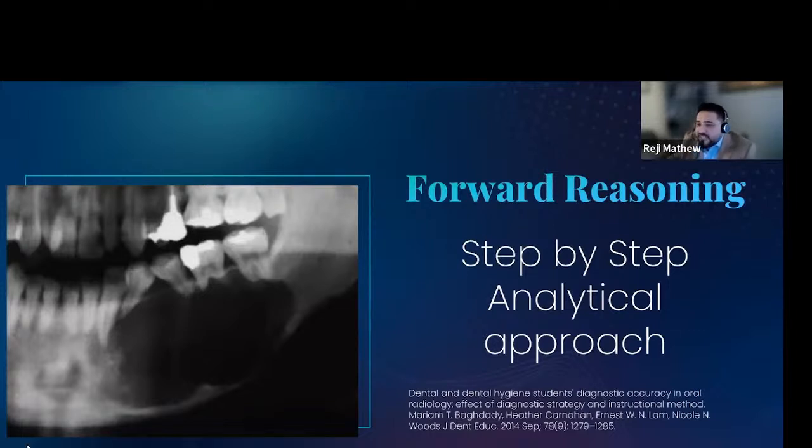Rather than jumping in and finding out what this lesion is, giving a name for that lesion and putting down multiple differential diagnoses, what we do is look at a lesion and see the extent of the lesion. We see what that lesion is doing to the structures around it. How does the periphery look? Do you see that scalloping pattern? Do you see that resorptive pattern? We can see the displacement of the premolars. We can see the thinning of the inferior cortex. I cannot see the inferior alveolar canal, and I'm fairly positive that it might be pushed downward. So we look at an image.